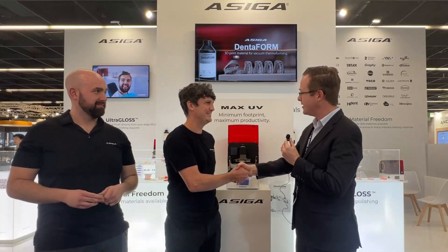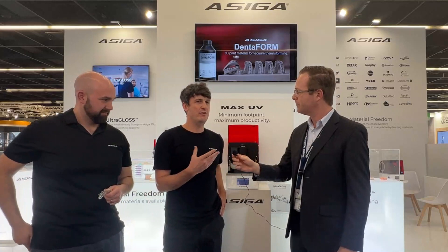Graham, tell me a little bit about what you're doing and what Asiga is. I run the marketing efforts for Asiga and work with our resellers across Europe, and Cory handles the reseller network in North America. We're here at IDS to present UltraGLOSS — that's our big development for the show and we're really excited about it.